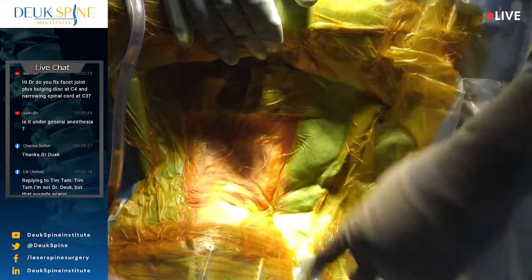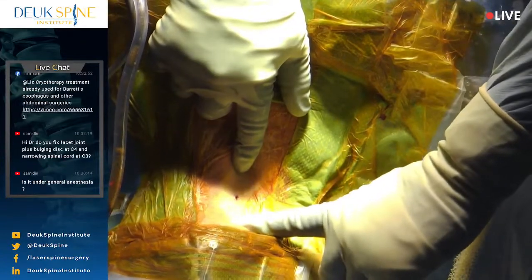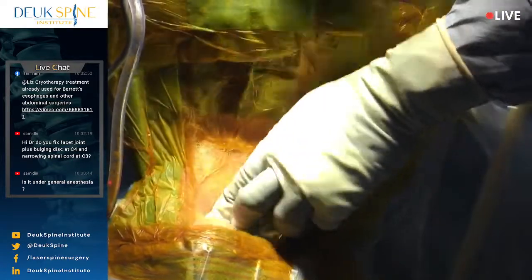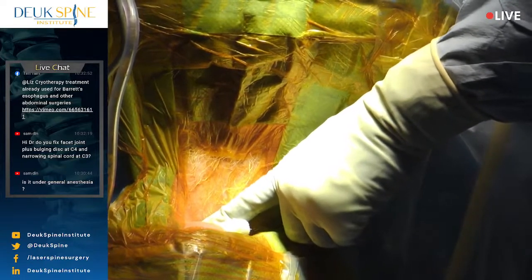All right, so let's look here. There's the incision, 4 millimeter. You won't be able to see it because of this chin, but it's tiny. And we're going to do another one here so you can see that one. All right, three drops of blood. We just increased our blood loss by 50%.